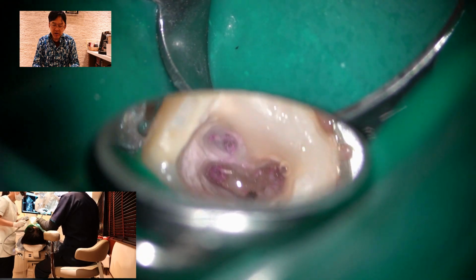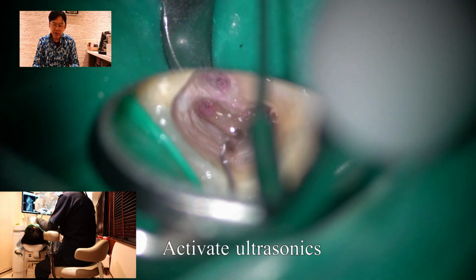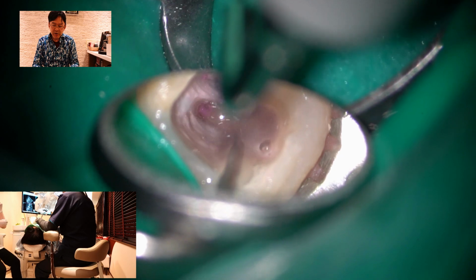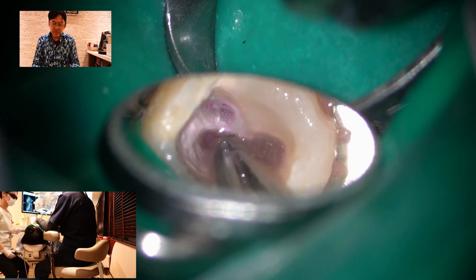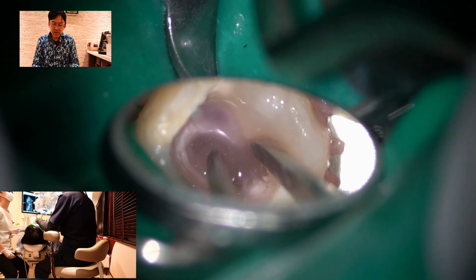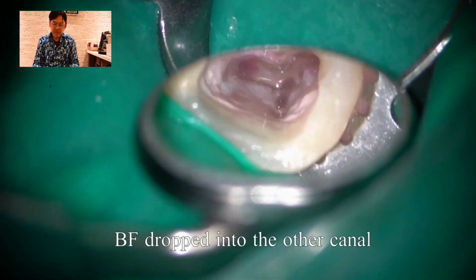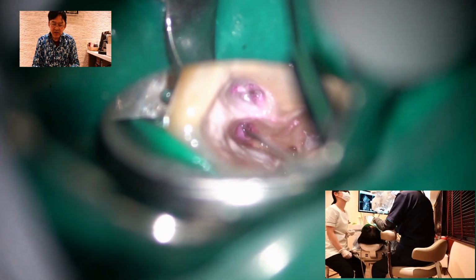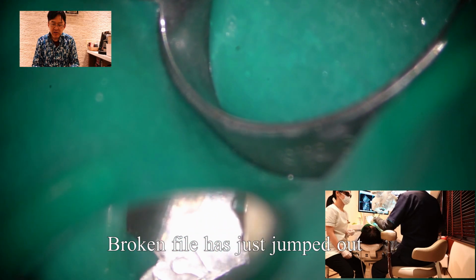So QMix 2-in-1 was filled in the root canal to facilitate broken file removal with ultrasonics. Now with ultrasonics activated, the instrument immediately came out. It's here. But it seems to be in a different canal. So I found it in a different root canal. I activated and it jumped out.